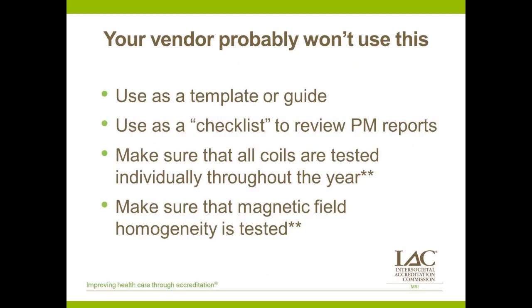One thing that will probably not work is you will probably not be able to print that form and give it to your service engineer and ask them to fill it out when they do your next PM. Every company that does MRI service has their own computerized system. Many of them are tied into their own standards. Just as your facility is accredited as a clinical provider of MRI services, the companies that supply the equipment and service it, in addition to having to be FDA approved, also have various other certifications like ISO and things like that. So they maintain very extensive systems, very extensive software.